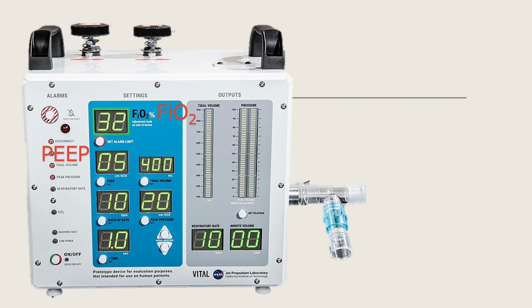Now, PEEP, that is how much pressure you would use to burst open the alveoli. Those stiff, collapsed alveoli, how are you going to open them up? You need to maintain a little bit of pressure at the end of expiration so that they do not all collapse. This is called positive end expiratory pressure.